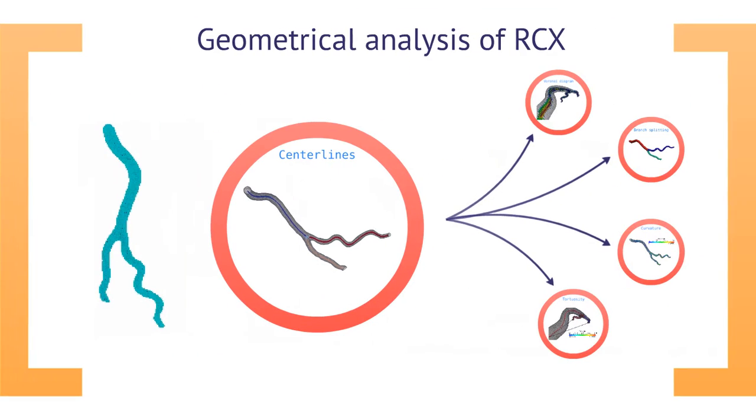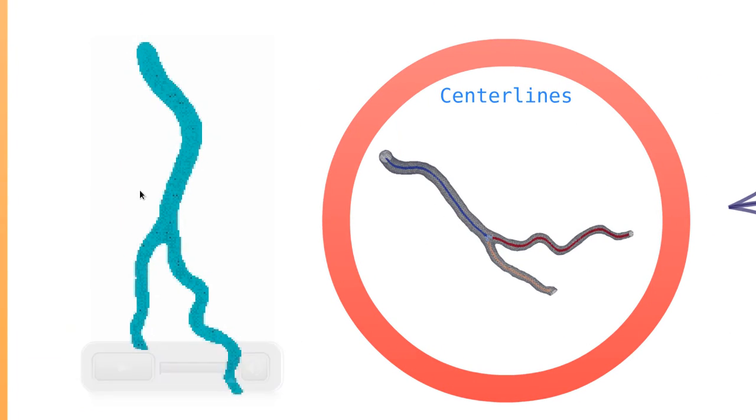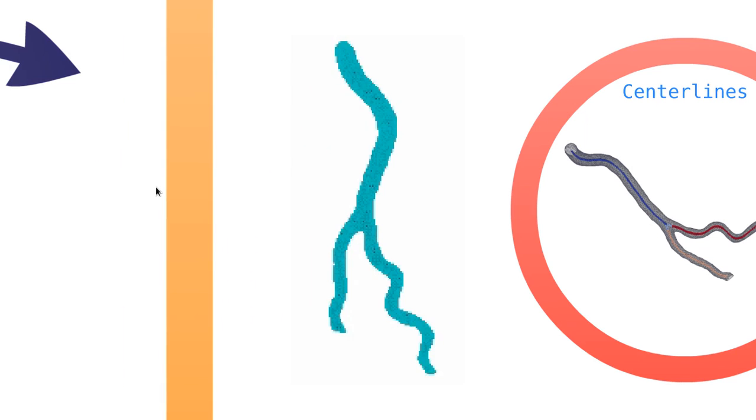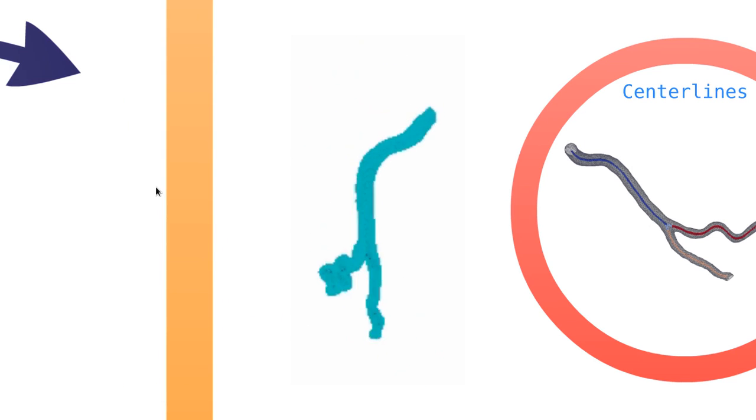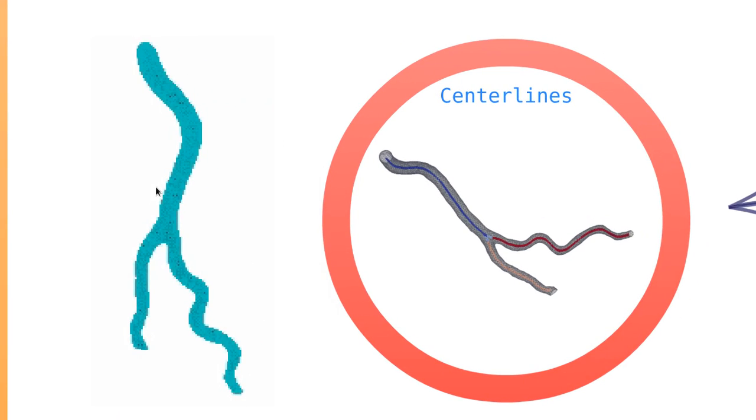In that case, we focus on the circumflex coronary artery, namely LCX, which is a branch of the left coronary artery. And here we can see the reconstructed surface using VMTK again, and the centerline representation. Centerline is a good way to represent geometrical information in vessels because, as you can understand, the centerline lies in the middle of the vessel through its whole path.